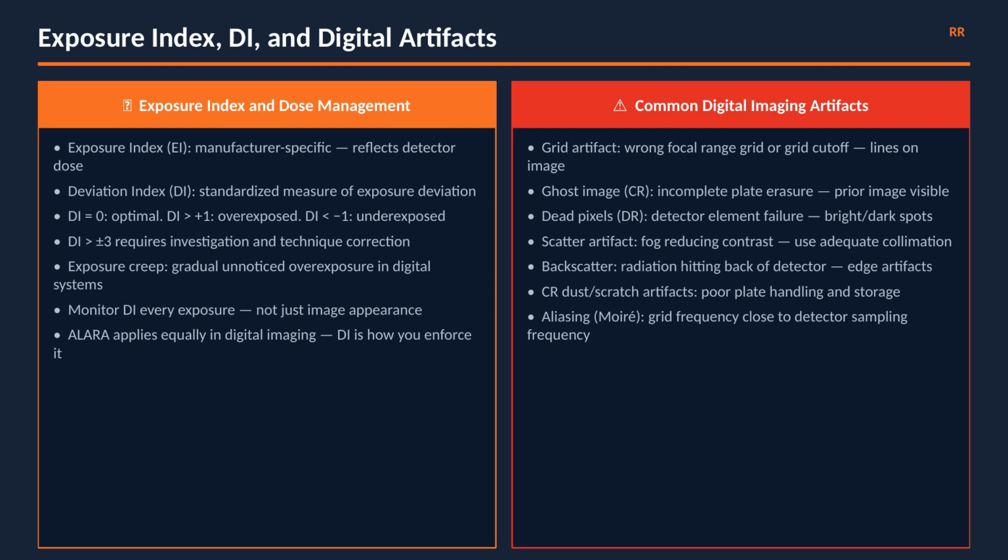Exposure index, EI, is manufacturer specific. It reflects detector dose, higher number means more radiation reached the detector. Know your department's EI scale and target values for each exam type.